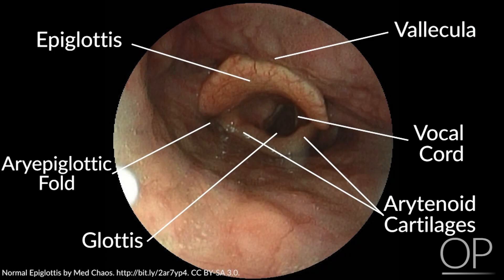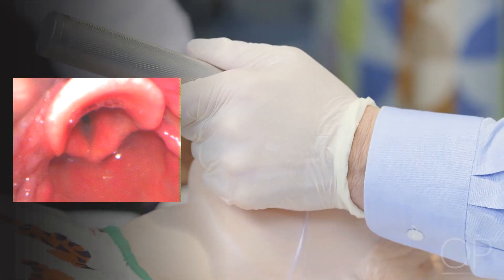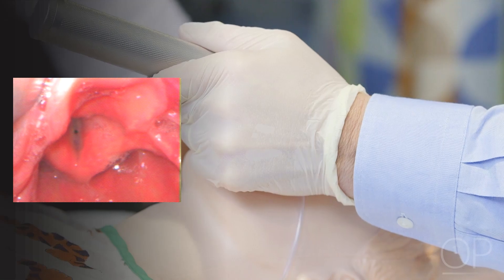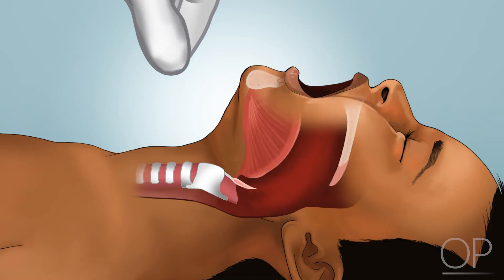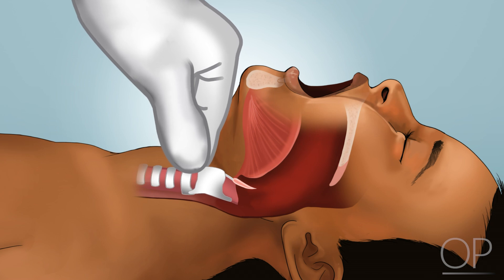Visualized anatomic landmarks can be used to guide laryngoscope position to visualize the glottic opening. Adjustments can be made to the laryngoscope insertion depth or the force being applied to the laryngoscope handle to improve visualization. Providers may also choose to apply a gentle downward pressure externally to the larynx to improve visualization of the glottic opening.